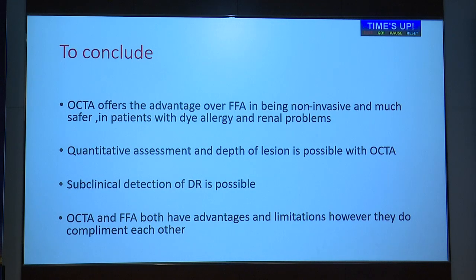However, OCTA and FFA both do have their own advantages and disadvantages, but they do very beautifully complement each other in the complete assessment of a patient having diabetic retinopathy.